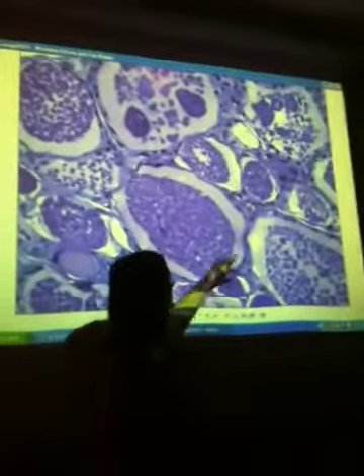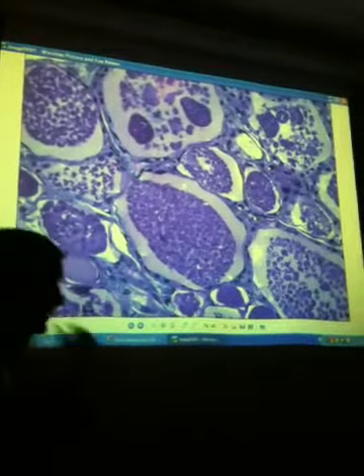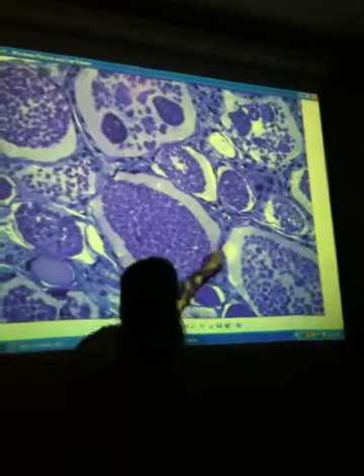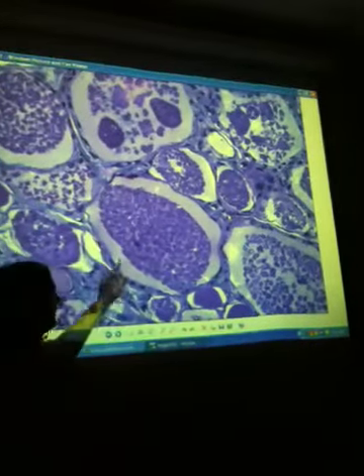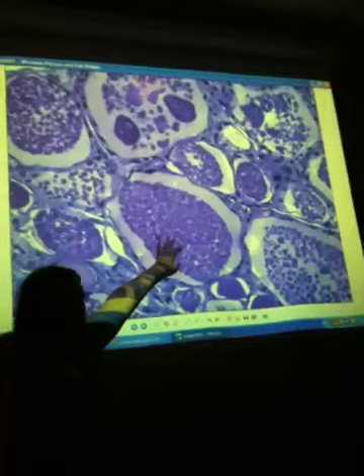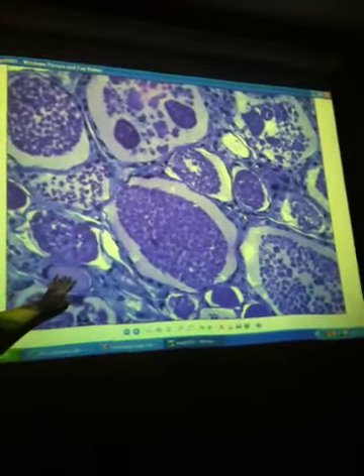Like this one that has lots of these big circles, those are the follicles. The picture makes it seem really purpley, but some of the cells are a little more pinky, so don't go by color, as always. They want you to be able to recognize the follicular cells, which are all of these squashed cells that make up the edge of the follicle. The colloid, which is all the stuff inside, could have cells or structures inside, is forming the thyroid hormone, or it could be solid, like this, either way.